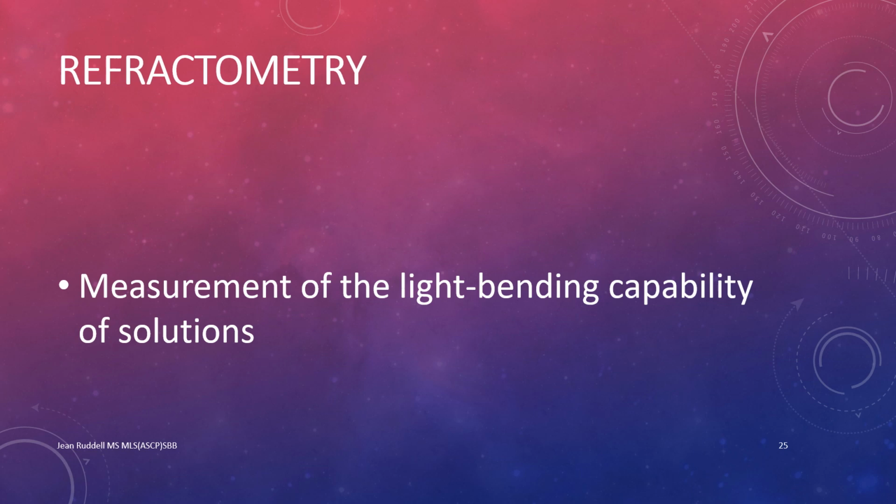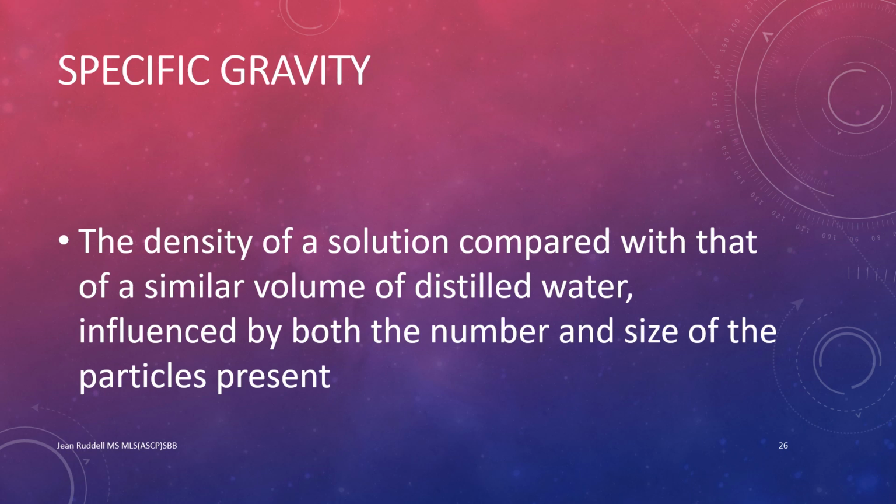Refractometry, a measurement of light bending capability of a solution. Specific gravity, the density of a solution compared with that of a similar volume of distilled water, influenced by both the number and size of particles present.